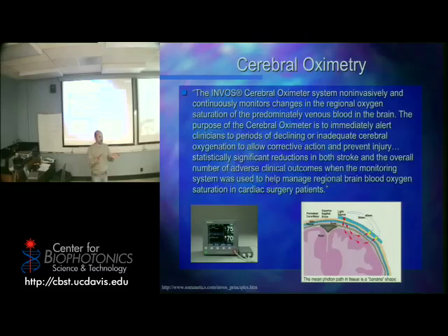So they know roughly that's where the majority of light comes through. Of course, the light goes in a circle, it doesn't just come out one particular spot. But if they can make a bright, bright light, what color light are they going to use?